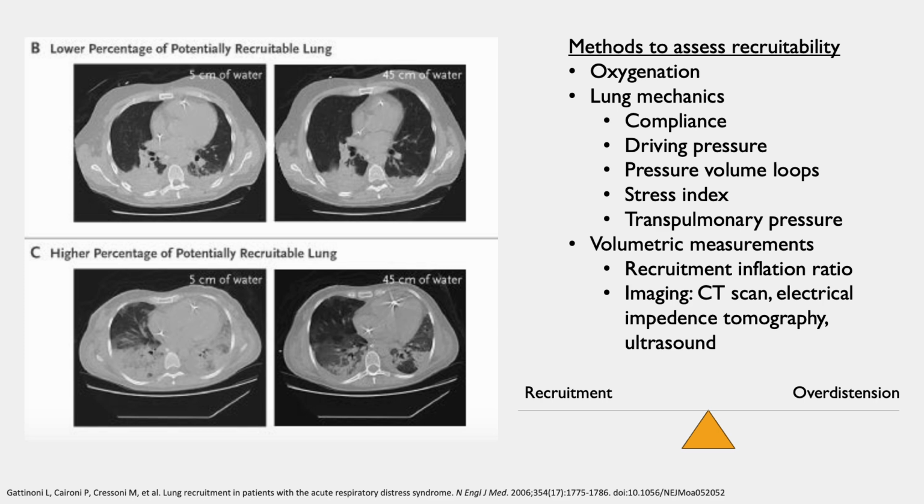The two main limitations of these methods are, firstly, lung recruitment and over-distension occur in a continuum and can occur simultaneously because of the heterogeneity in the state of the alveolar units. What is measured in these techniques provides an aggregated value of sorts, and while pursuing an optimal value of compliance may be attractive, injurious over-distension is not precluded even at this point.